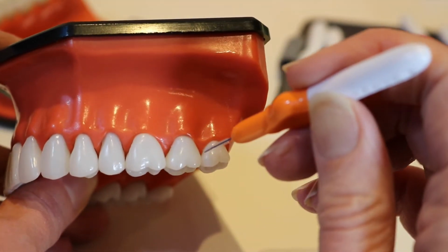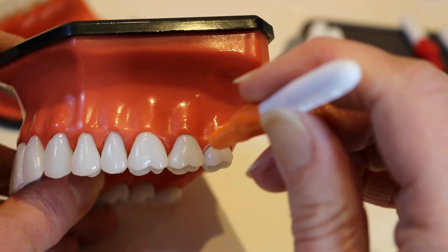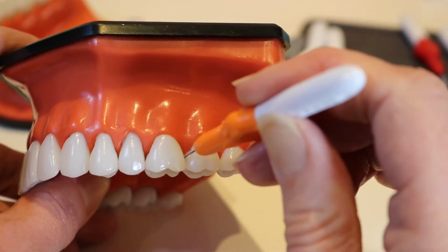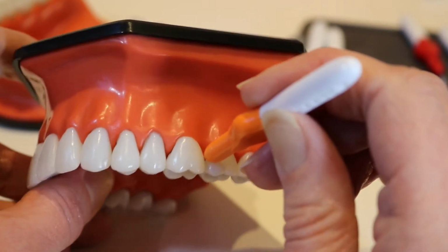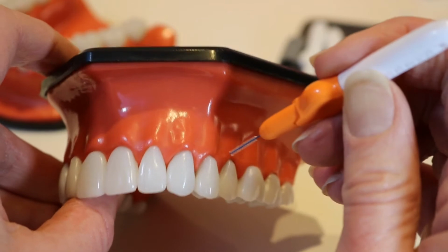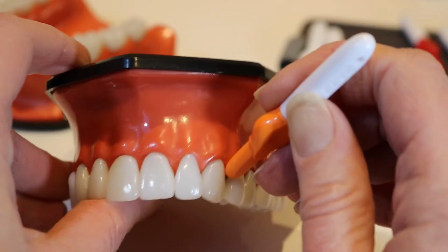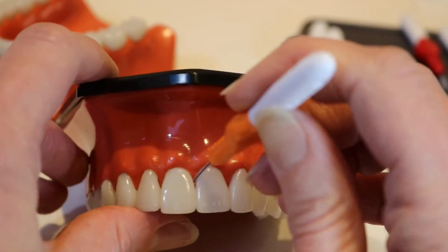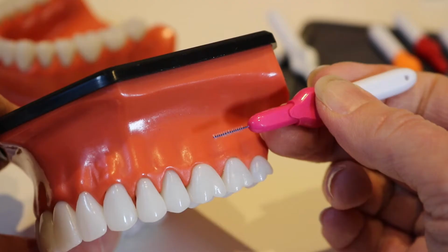Yes, it goes through nicely at the back there. And it goes nicely through the gap there. We've got our blue one for here, blue for here, green for here. Doesn't go through there, doesn't go through there, and again we've got our blue for that gap. So I'll move to our pink one.